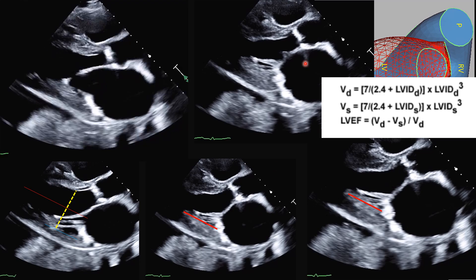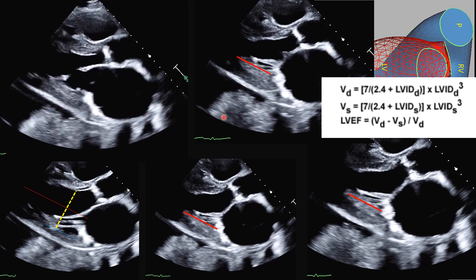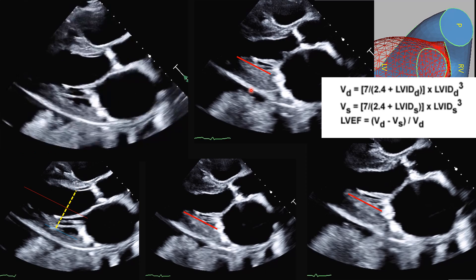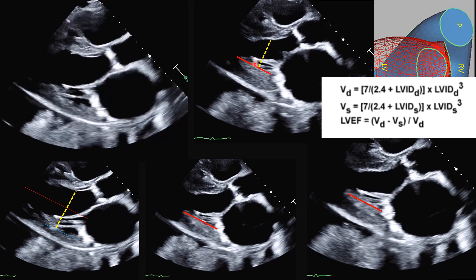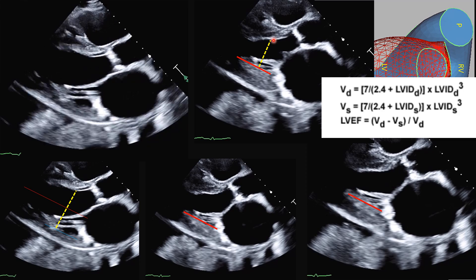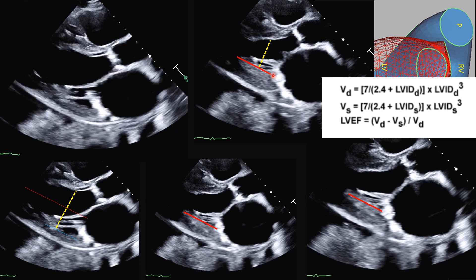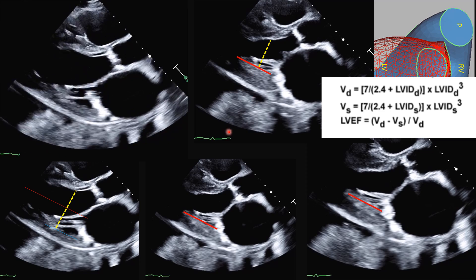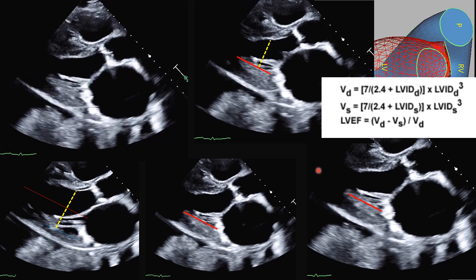At end-systole, we measure at the same spot used for the diastolic measurement — the same spot, perpendicular to the left ventricular long axis. The same approach applies to both diastole and systole. We make sure we do not include trabeculations, chordae tendineae, or papillary muscles. That is how we perform this measurement.